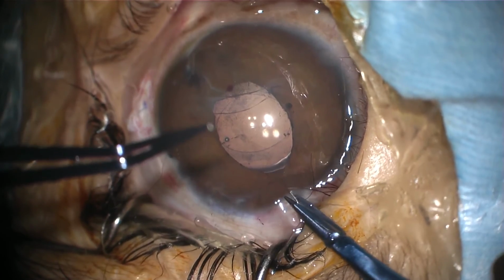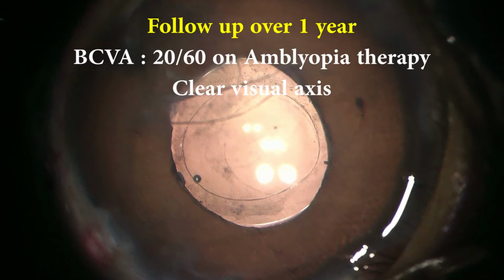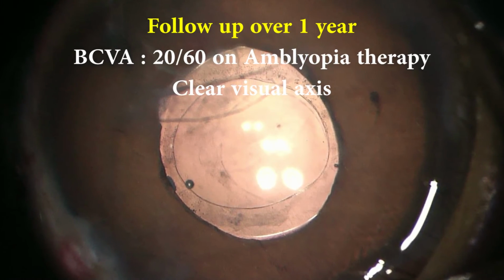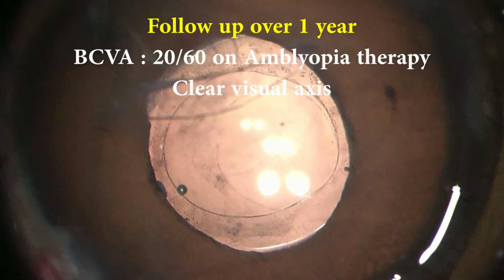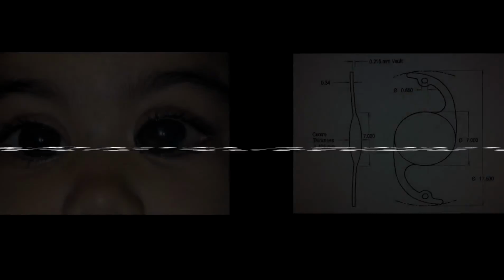Over 1 year of follow-up, the child achieved a visual acuity of 20/60 in the left eye with a clear visual axis and stable intraocular pressures, and is currently undergoing amblyopia therapy. To conclude, intraocular lens placement in a buphthalmic eye is a challenging task. Bigger IOLs, customized according to the size of the eye, may be a better alternative in such cases to achieve optimal visual outcomes. Thank you.